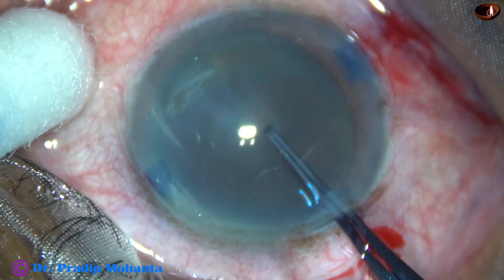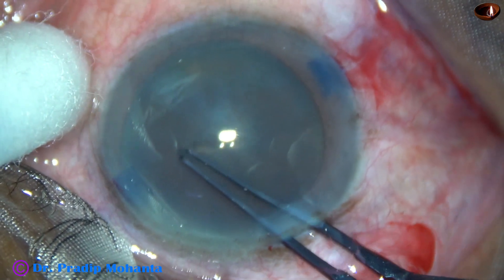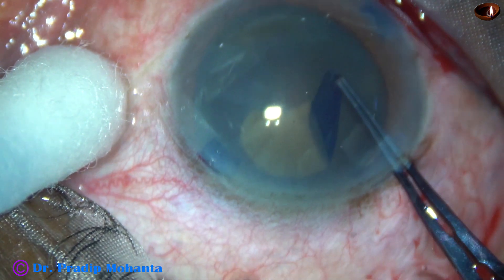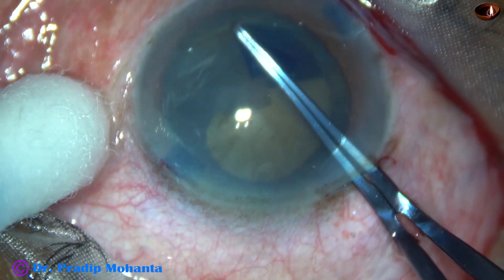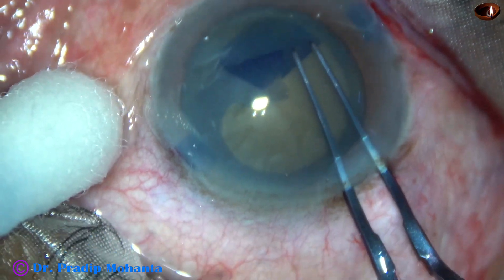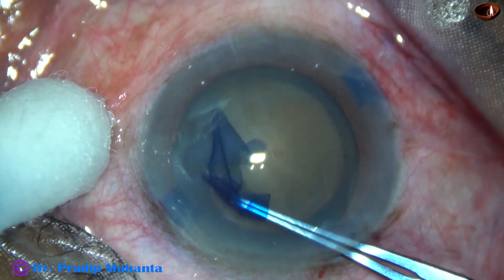Now the anterior capsule is torn by the utrata forceps and the capsular tag is raised. The tag is held with the utrata. Remaining at a certain distance away from the margin of the dilated pupil, an adequate size rhexis is being done.